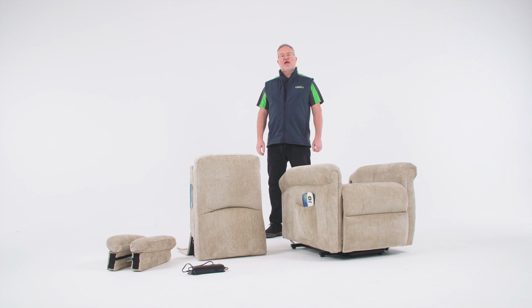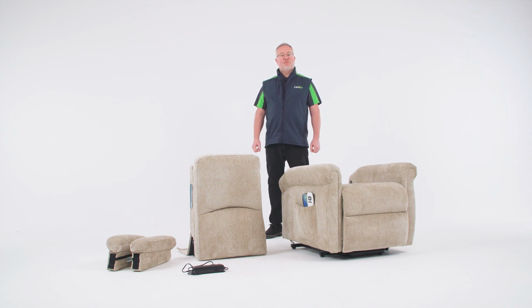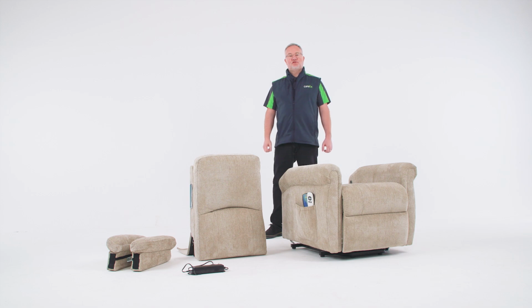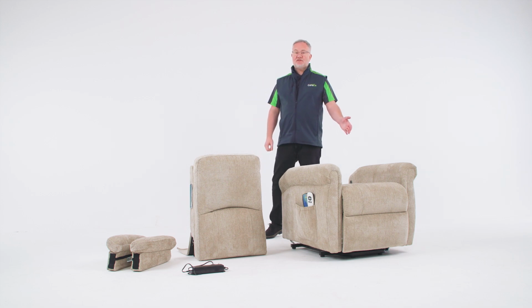Hello, I'm Simon from CareCo, and I'm going to show you how to assemble the Savoy Heat and Massage Riser Recliner chair. As you can see, I've taken all of the components out from the packaging and I've placed that to one side. In front of me, I have the main Savoy chair base.